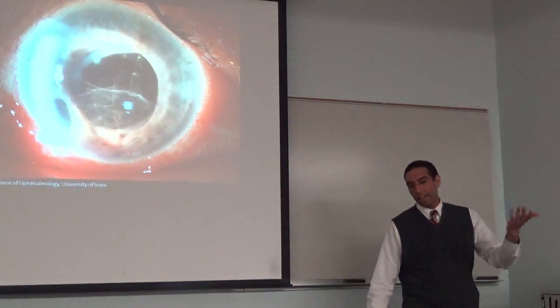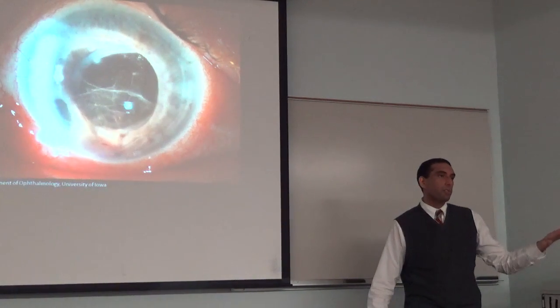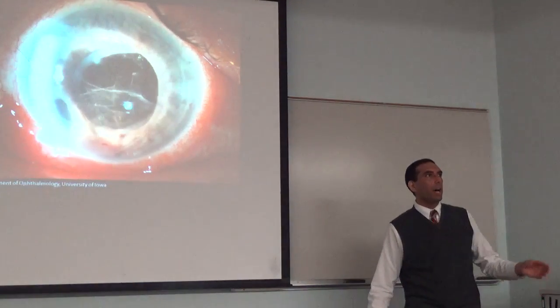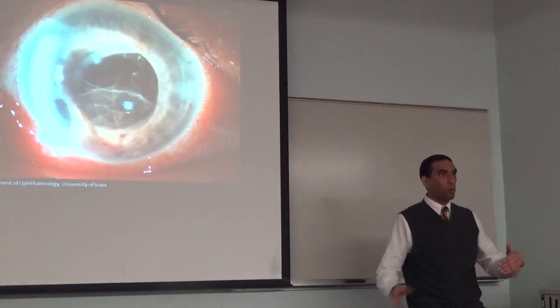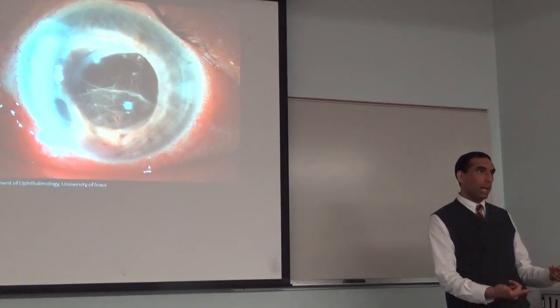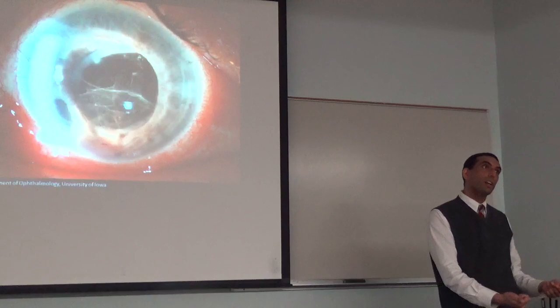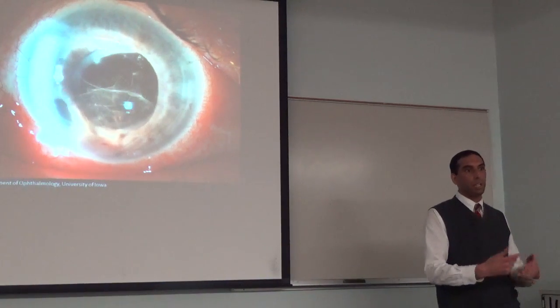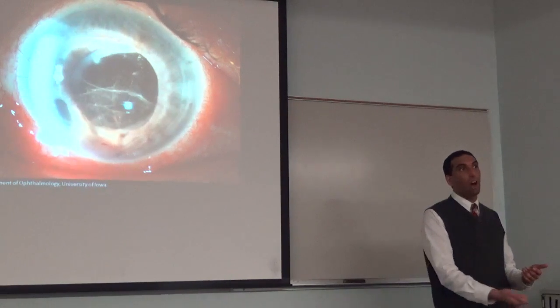Then what we do is, and I'm happy to say I've been involved in a number of these surgeries back when I was at Penn, and hopefully we'll start doing them at Louisville at some point. We can do a retinal surgery where we remove the vitreous gel, which is standard for us. We go in, we create a localized retinal detachment, and we inject the virus, about 300 or 400 microliters of solution that contains the engineered virus, underneath the retina.